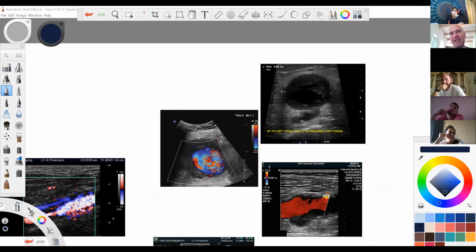In this case, in the legs, the extremities, the diameter is 1.5 times the previous segment.